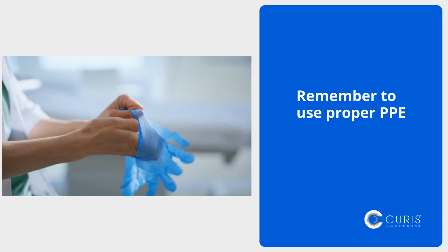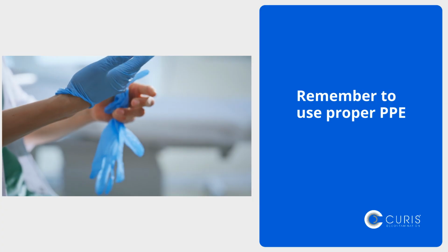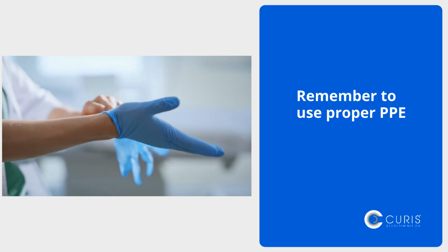And finally, safety. Neglecting PPE or failing to monitor vapor systems for leaks can expose personnel to hazardous chemicals.